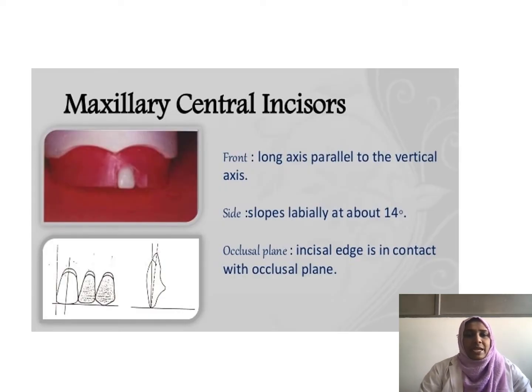Today we are going to discuss teeth arrangement in complete dentures. There are some ideal requirements to arrange the anterior and posterior teeth. Phonetics and aesthetics influence the arrangement of the anterior teeth, and the crest of the ridge and the compensatory curves also affect the arrangement of the posterior teeth. So let us know how to arrange the central incisors, that is, the anterior teeth.